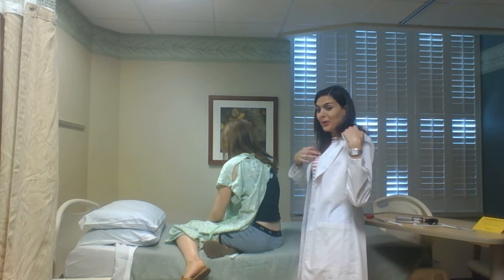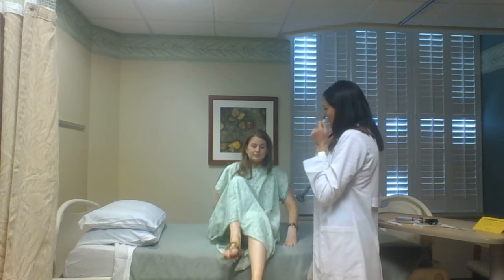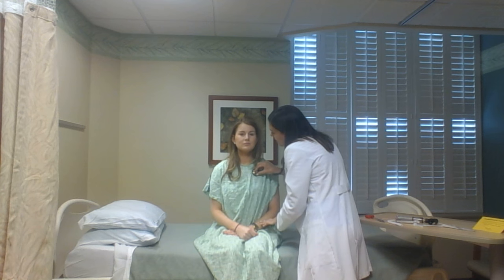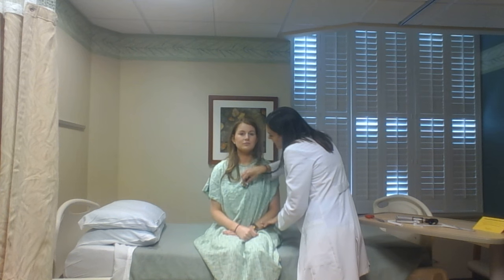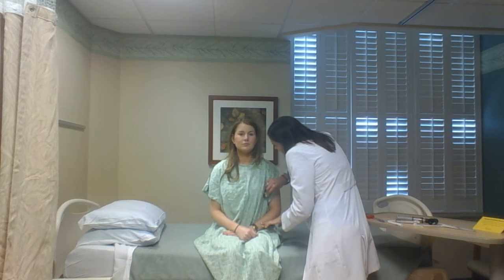And now I'm going to listen to her heart, if I could have you turn around. So I'm checking the aortic, the pulmonic, Erb's point, tricuspid, and mitral areas. And I can hear S1 and S2. They are clear. She has no extra heart sounds.